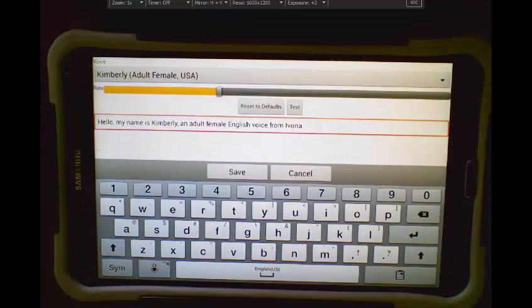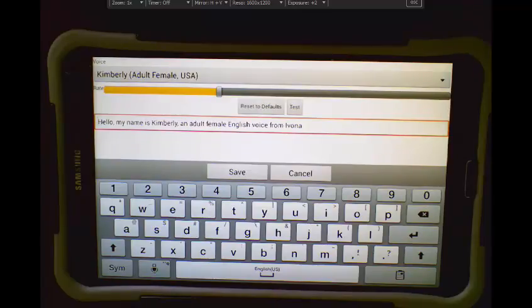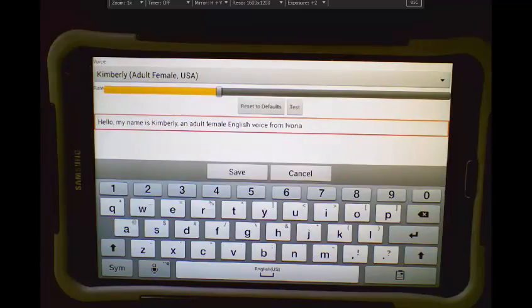Currently, I'm using the Ivona Synthesizer, so I see the voice that's already loaded, and I can slide the bar back to slow the rate of speech. Let's give it a test with the sound the way it is now.